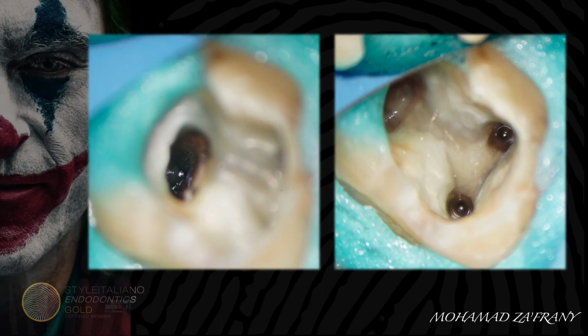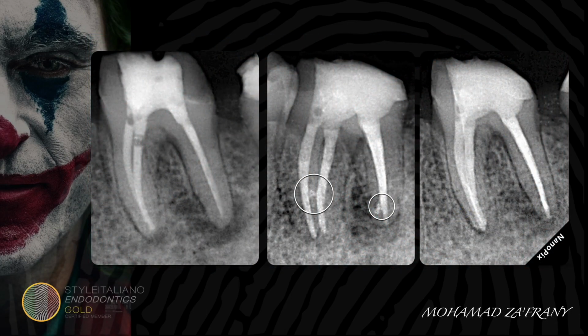Here is the case after cleaning the canals and removing all remnants of pulp tissue in a proper way. And here is the case after obturation. You can appreciate the presence of the mesial isthmus in the mesial root and a lateral canal in the distal root. For sure, we can anticipate a good prognosis after providing good quality treatment.